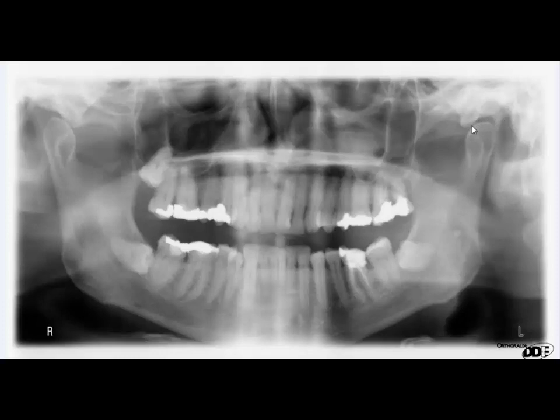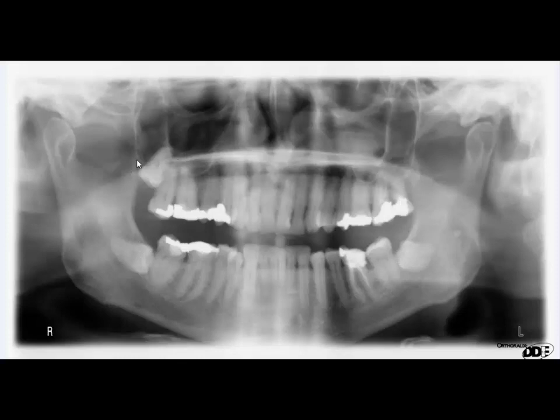In this X-ray you can see the condylar head is very clear. This is the coronoid process, and this is the condylar process of the mandible. Regarding the wisdom teeth in this X-ray, you can see the right third molar, left third molar, left upper third molar, and right upper third molar — all these third molars are present here. It is very clear that the lower right and left third molars are horizontally impacted, and this tooth is also impacted.